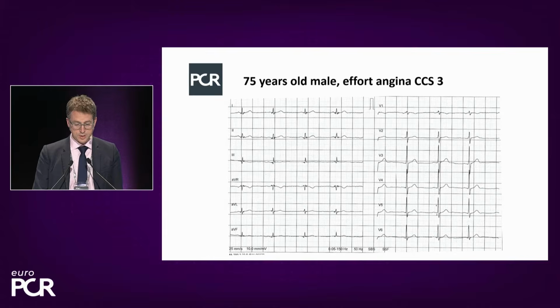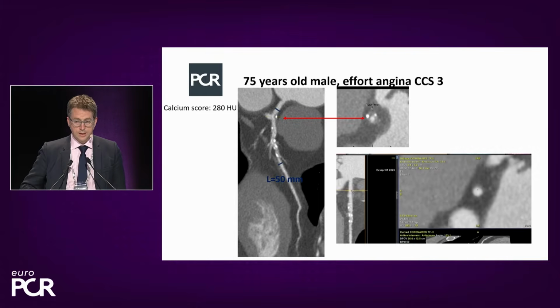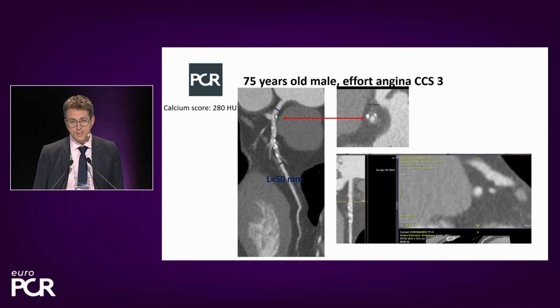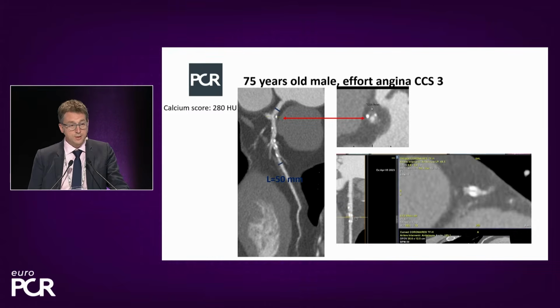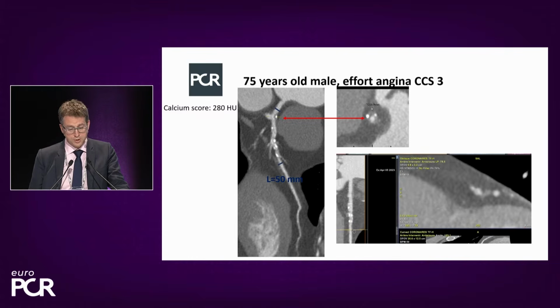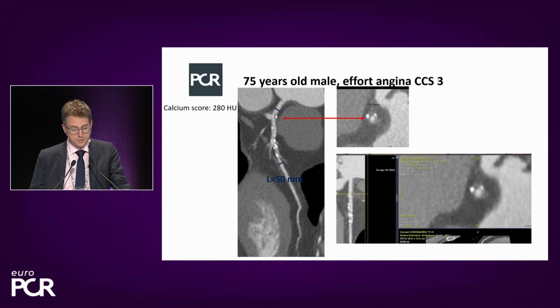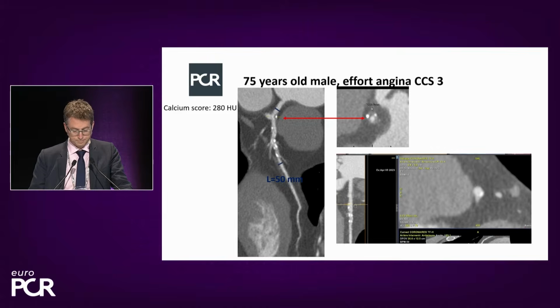This was his resting ECG. He's had an echocardiogram with normal LV function, no significant valvular disease. And I think really most importantly, it's an opportunity for us to review his CT scan before coming to the cath lab. And certainly this is something that increasingly in our practice we are trying to make time for, because there's an incredible amount of information and opportunity to be obtained in assessing these CT images prior to embarking on the procedure.